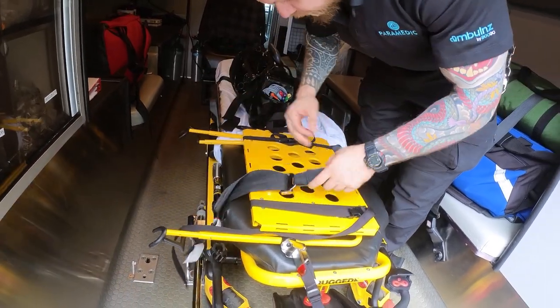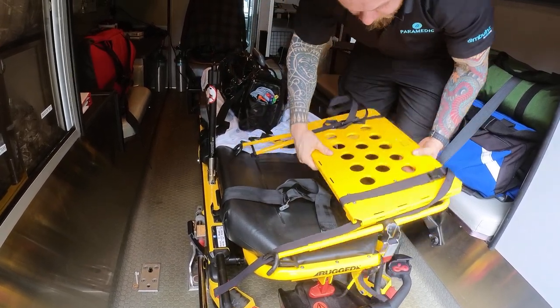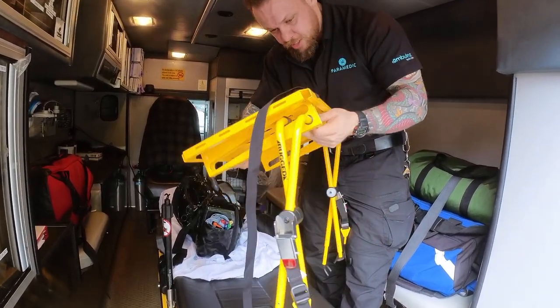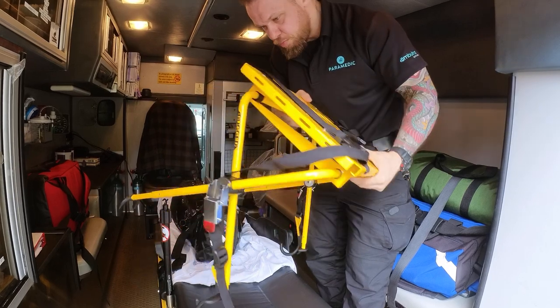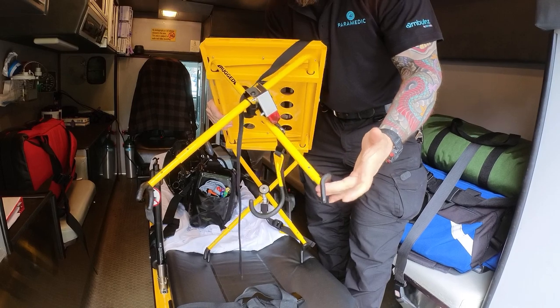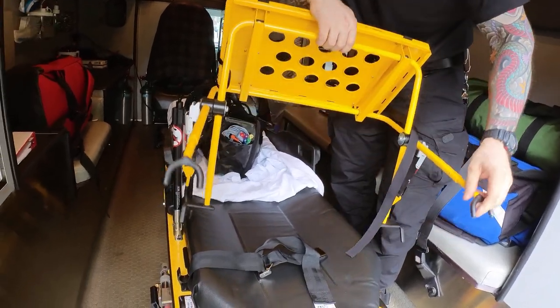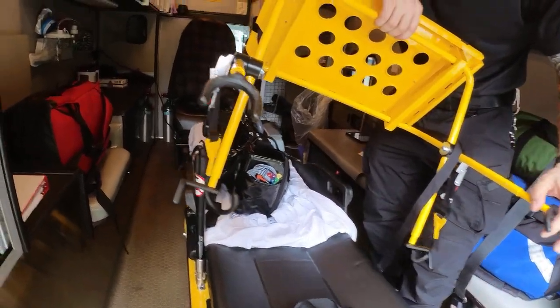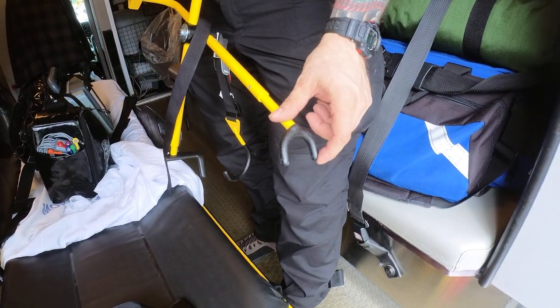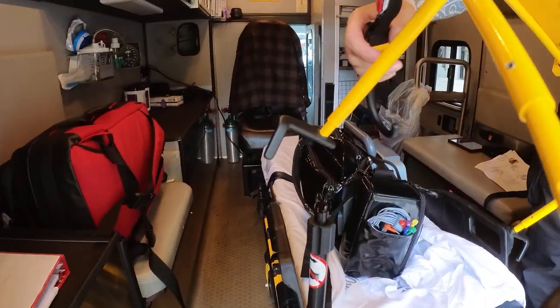The first thing is you need to make sure your IV pole is in the upright position. Once the IV pole is up, this is how the device comes in storage position. I'm going to open this up and point your attention to two different types of legs. These legs with the double connection are going to be towards the foot end of the stretcher, and these legs are going to be towards the head end.